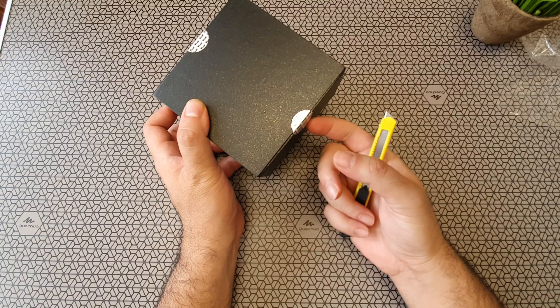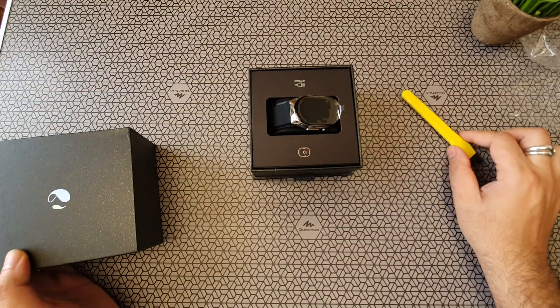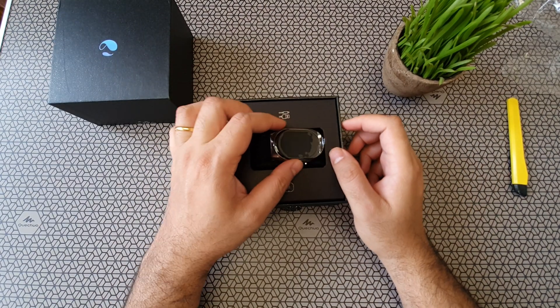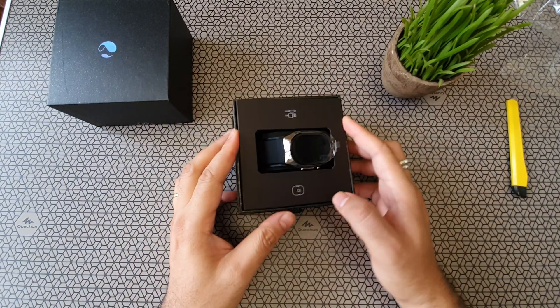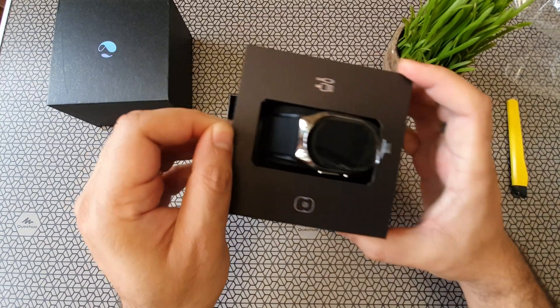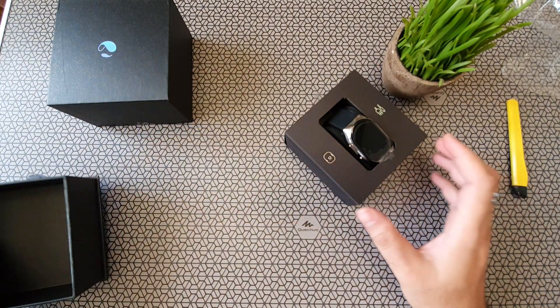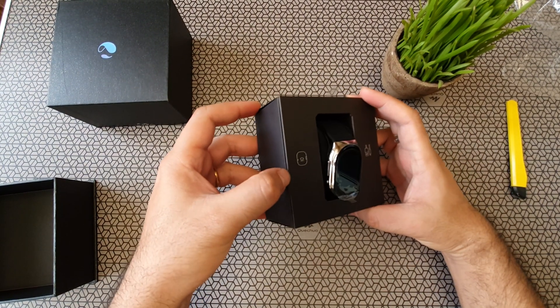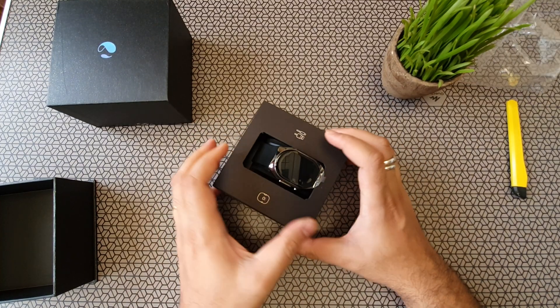So the box is actually sealed, but the seals seem to have come off for whatever reason. Inside, I can see there's a small watch right in the middle, and it's got a protective plastic coating on it. There's a small latch to pull the whole thing out, and nothing else visible in the top section. And here's the watch — it looks like it's got side compartments, obviously hiding some cables or something.